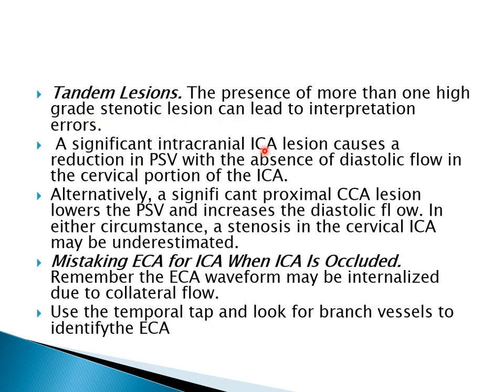A significant intracranial stenotic internal carotid artery lesion causes a reduction in the peak systolic velocity with the absence of diastolic flow in the cervical portion. Alternatively, a significant proximal common carotid artery lesion lowers the peak systolic velocity and increases the diastolic flow. In either circumstance, a stenosis in the cervical internal carotid artery may be underestimated.